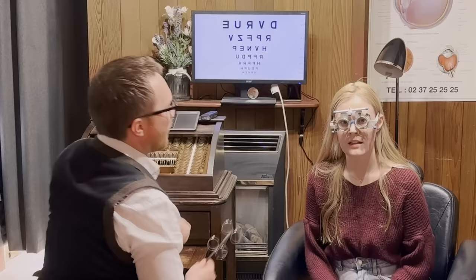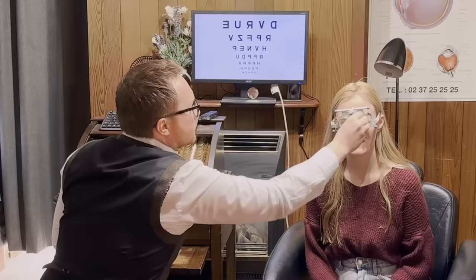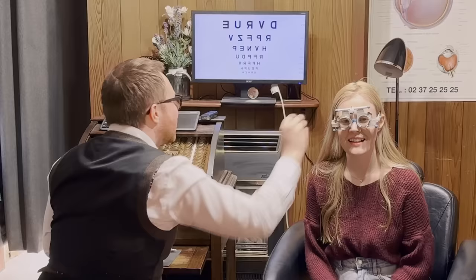And looking at the bottom two lines, are they a bit better when I put this in front, or is that making them go a bit blurry? Going blurry. Better without, yeah. And let's just move this blurry one over to your other eye. So have a few blinks, let your eyes switch around. Just feels quite odd, that one.